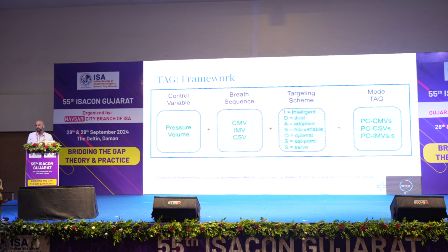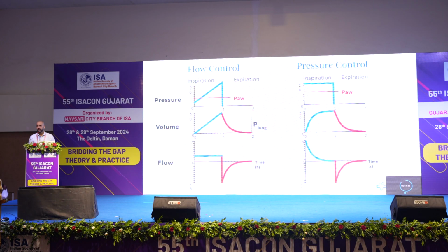Medicines have a trade name and a generic name: paracetamol versus Calpol or whatever other names you have. Similarly, ventilator modes have names like PRVC, Autoflow, whatever. That mode tag is the generic version of that. So for you to know what the mode is actually doing, you can't rely on the trade name. You have to rely on the generic name, which is the tag. This is something to identify before we go into all the steps that I listed.